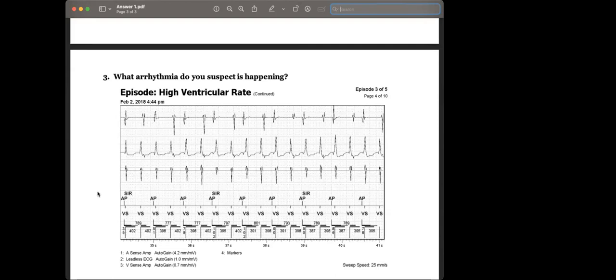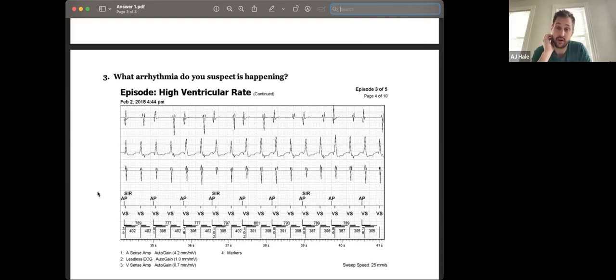Hello. Yeah, Elvis. Well, I think it looks like some kind of re-entry. I don't know, because the AV interval is very short, and that's not physiological. I'm not sure, but it's obviously not a true ventricular high rate. Something is going on somewhere, like a retrograde conduction or so. I'm not sure. You have good instincts.